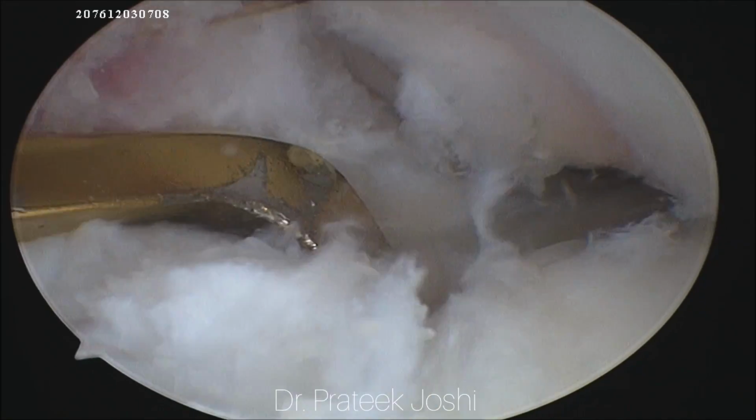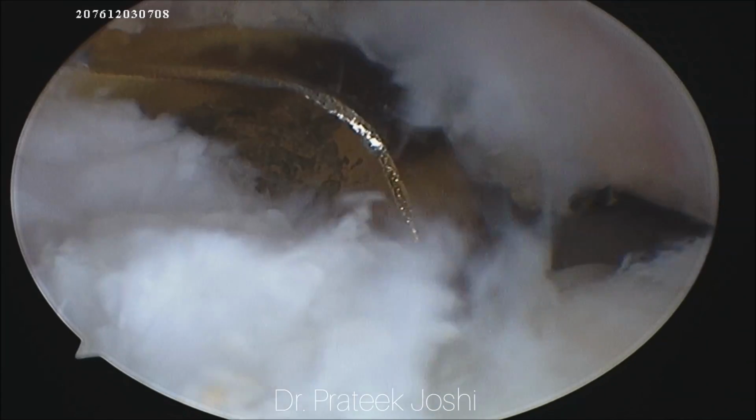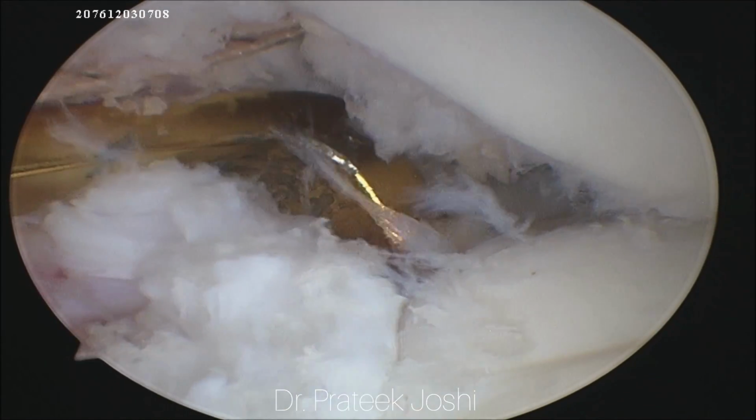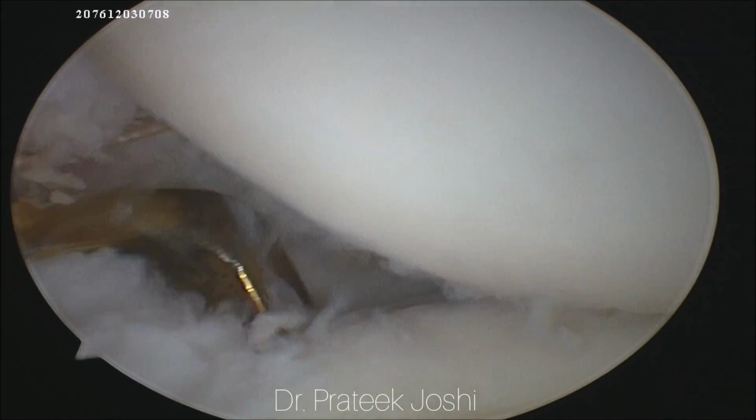So now we are going to start the process of drilling the tibial ACL tunnel, for which I have introduced the ACL tibial jig, which has been kept at 55 degrees of angle. This is elbow aimer tibial ACL jig.